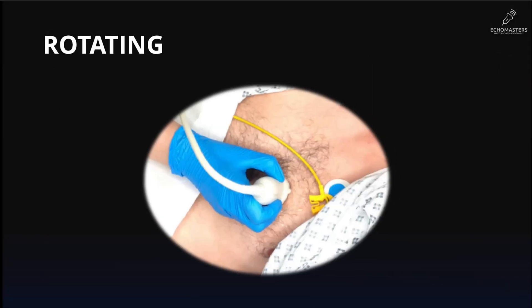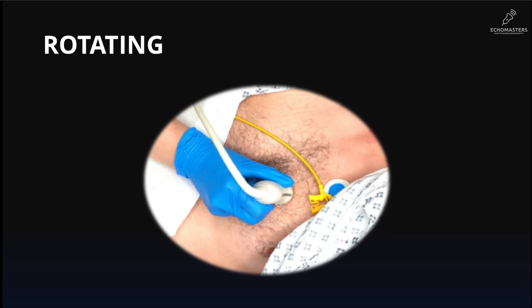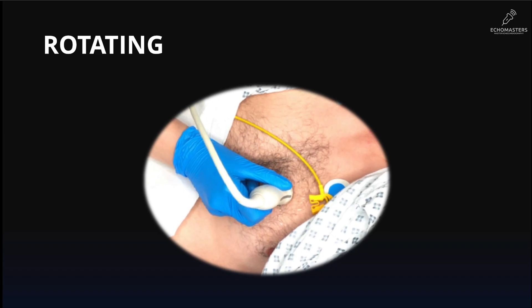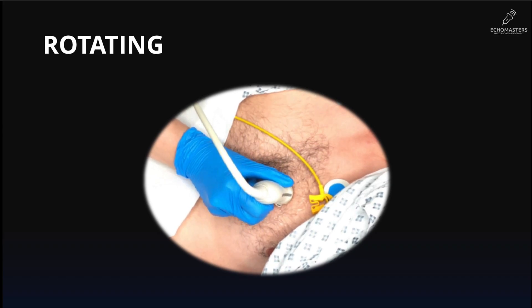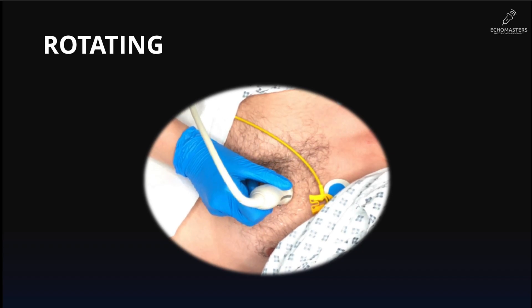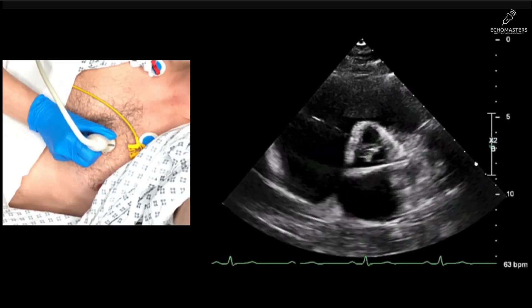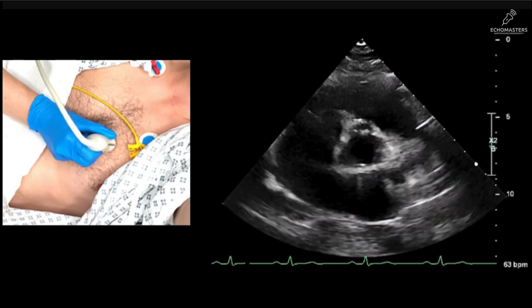Now for the fourth primary movement: rotating. This is turning the probe on its central axis, just like turning a key in a lock. The probe's footprint stays in the same intercostal space. This isn't a fine-tuning move — this is our powerful move. It completely changes our perspective, changing the longitudinal axis to a cross-sectional axis. Watch how we rotate the probe 90 degrees clockwise from the parasternal long axis view to get the short axis view.